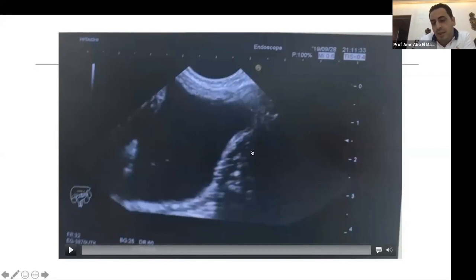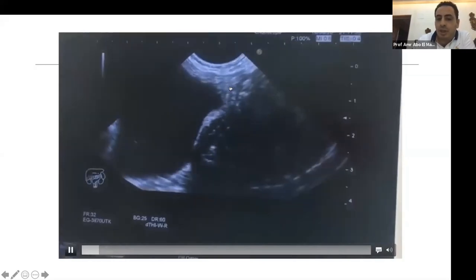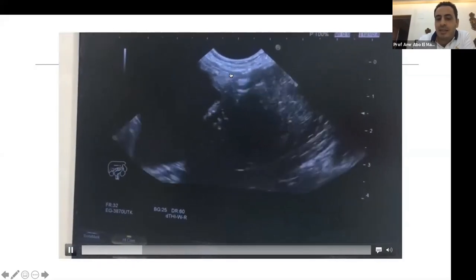Located inferiorly here is the prostate. The prostate is of conical shape, with a base and apex. And this base is located at the neck of the bladder. And the prostate has an important structure located posterolateral to it, the seminal vesicle.